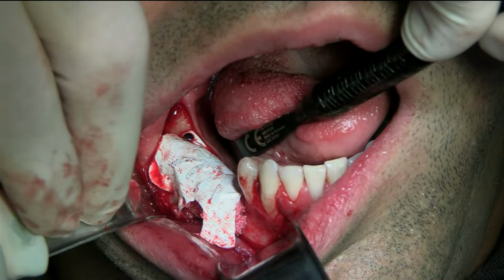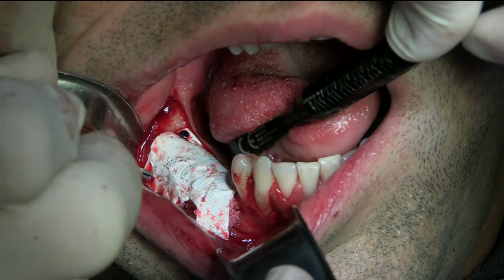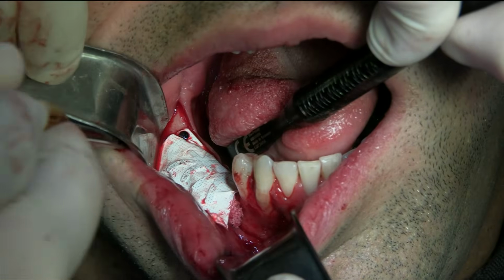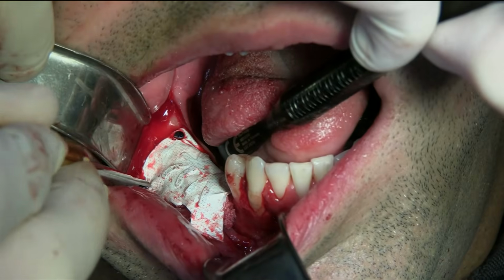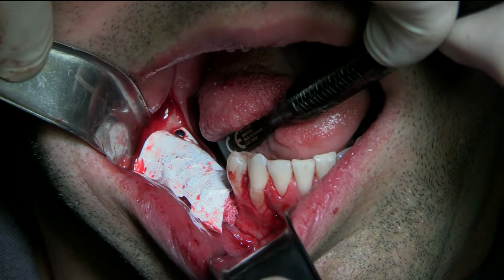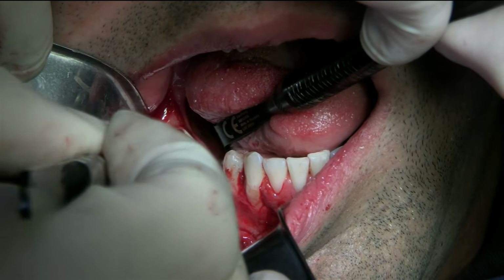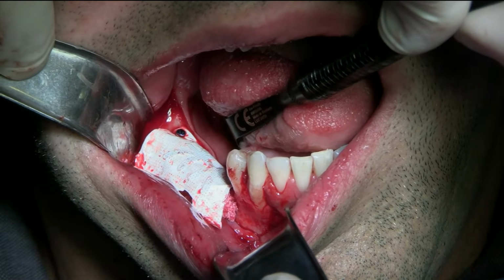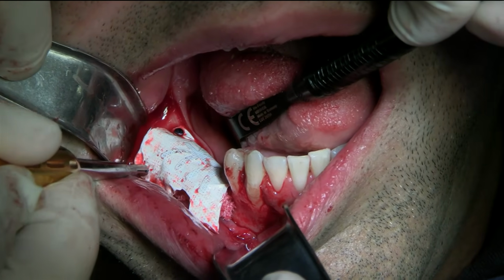I got this one. So I'm going to move the membrane down so it's in a nice position. Okay, it just came loose. Yeah, I got it. So I'm pushing the membrane down, so I just removed the tack from the holder. Can you give me another one? Ready.